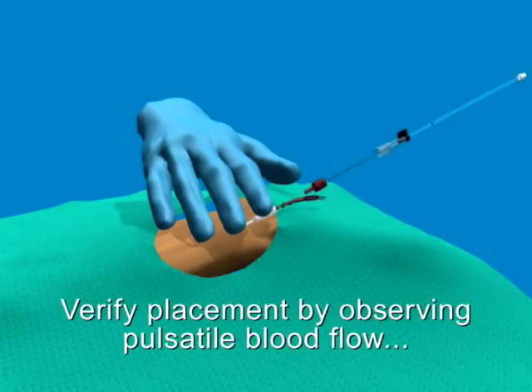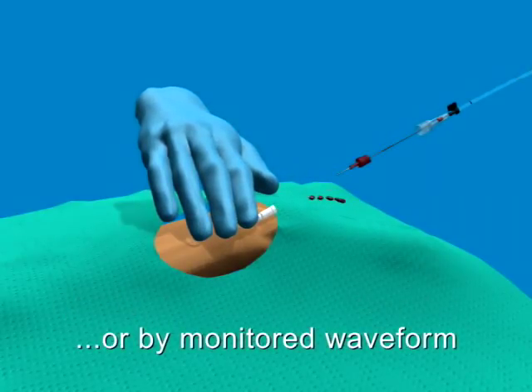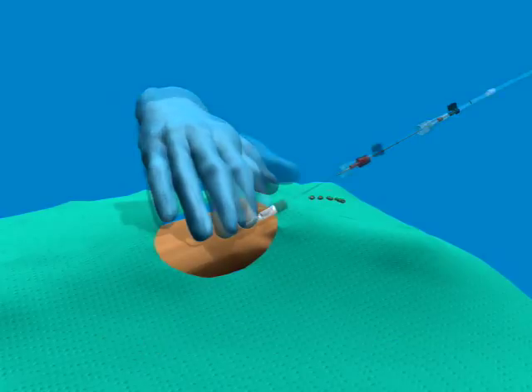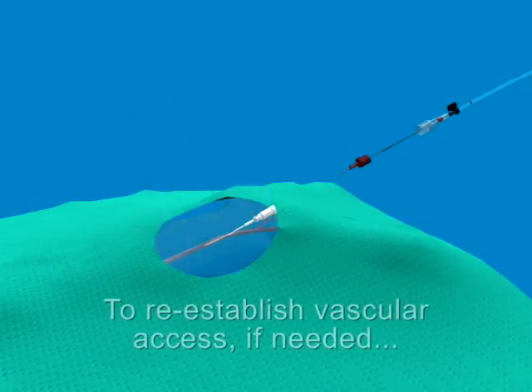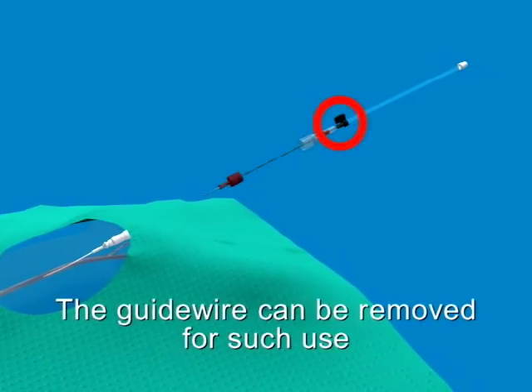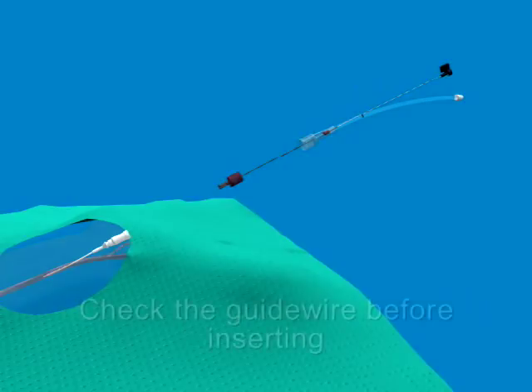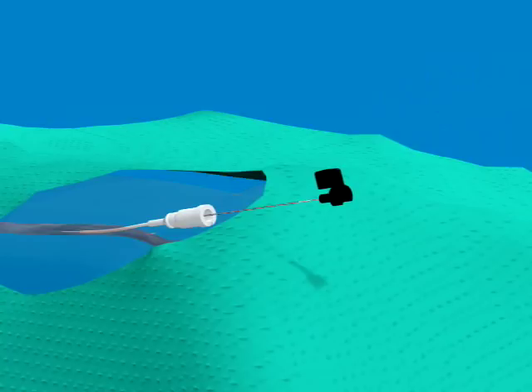Verify the arterial placement by observing the pulsatile blood flow, or in cases of low flow, verify by the monitored waveform. If there is no flow from the catheter, you will need a wire to re-establish vascular access. This product is designed so the integral guide wire can be removed from the needle and feed tube by pulling up on the wire handle. Withdraw the wire gently to avoid blood splatter. Examine the wire for any damage after pulling back through the needle. If the wire is frayed, a new wire or new device must be used.